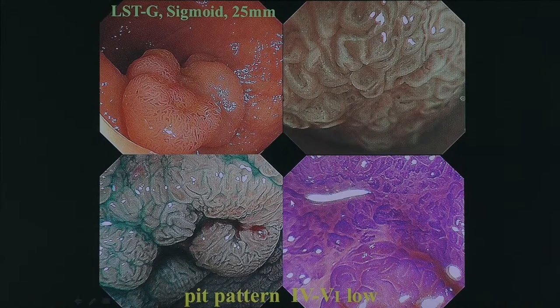The pit pattern was type 4, type 5i, low grade, slightly irregular.